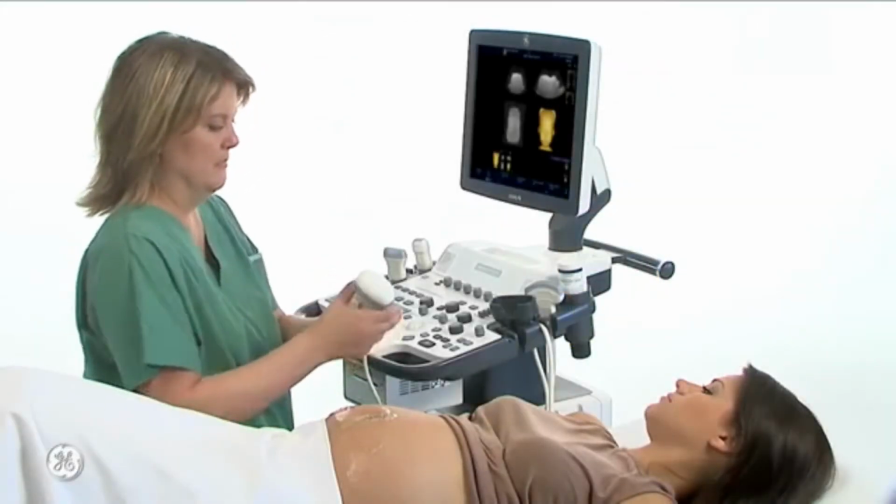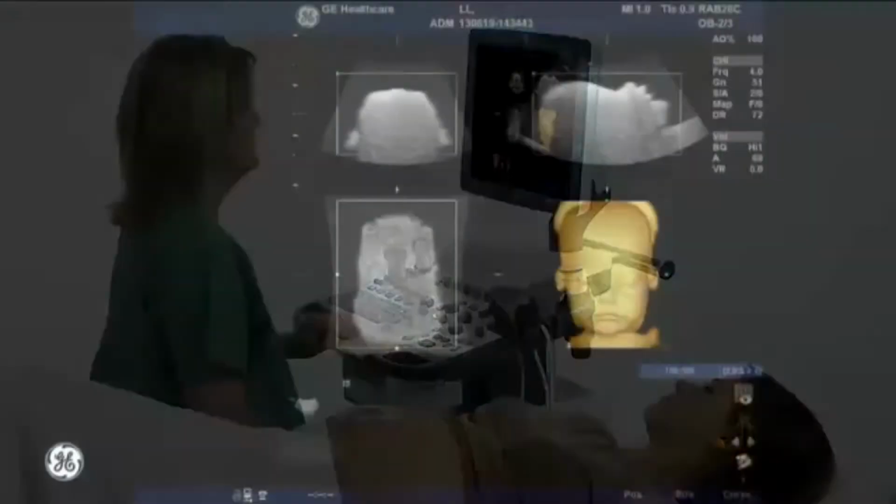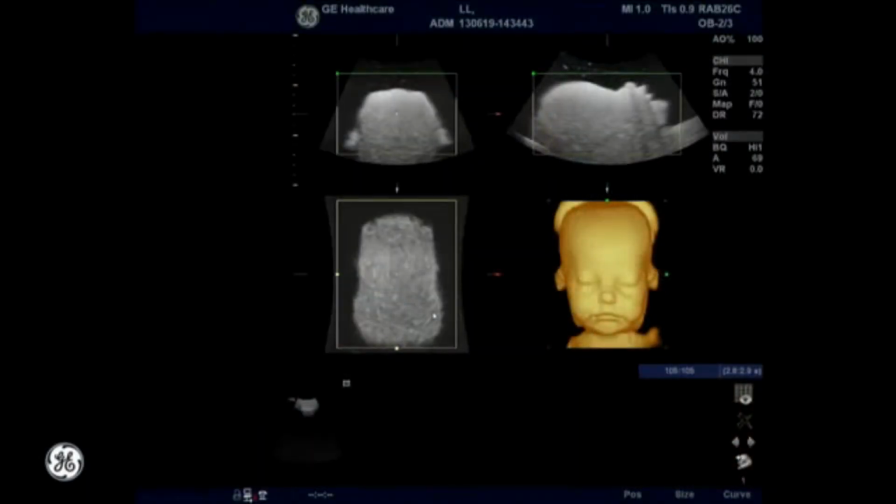After completion of sampling, the acquired volume is displayed in a multi-planar mode, consisting of 3 perpendicular planes, A, B, C, and the 3D rendered images on the lower right corner will be displayed on the main screen.